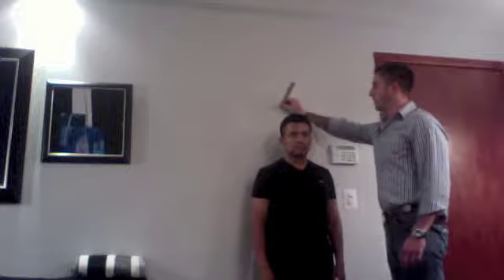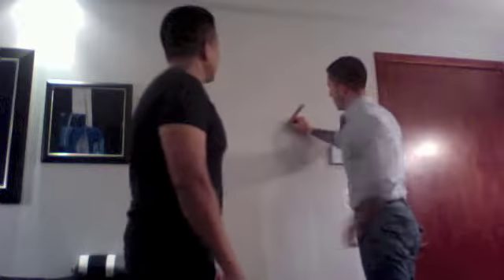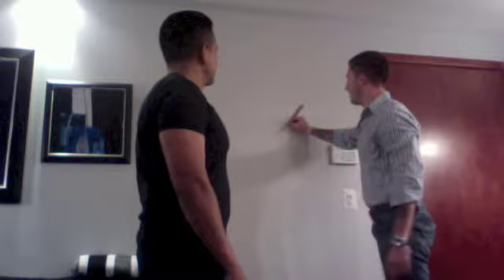Then you want to lower it. So stand up nice and tall. Alright, then have the patient step off. And you want to read the inches line on here. So for him it's 67 inches, so he is 5 foot 7 inches.